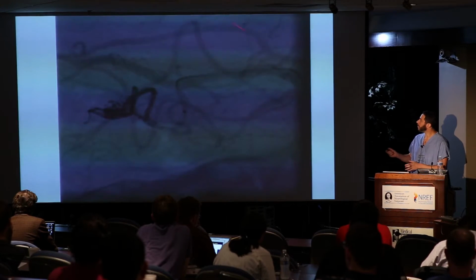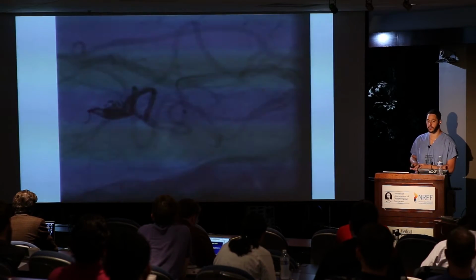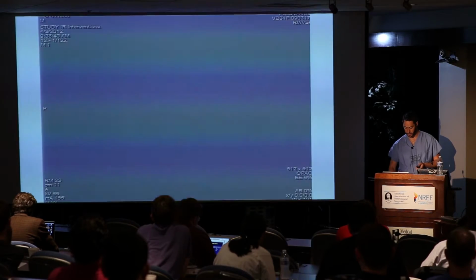And there you can see the PCA. There's a detachment zone, which is well within that temporal branch. So that gives me a modicum of comfort that when I detach it, it's going to stay there. But that's what I was really curious to see.